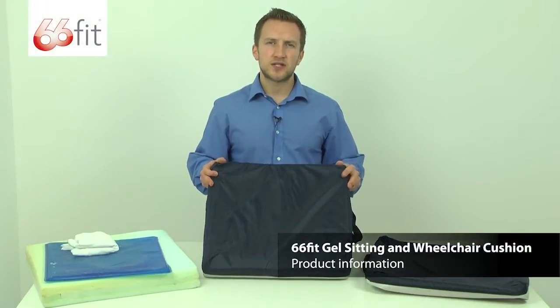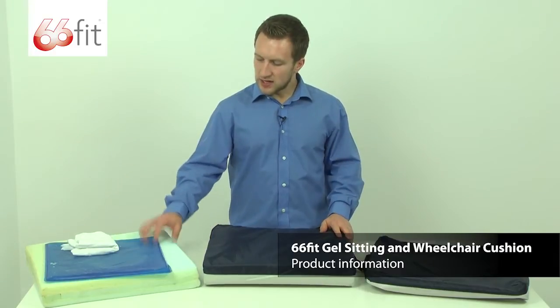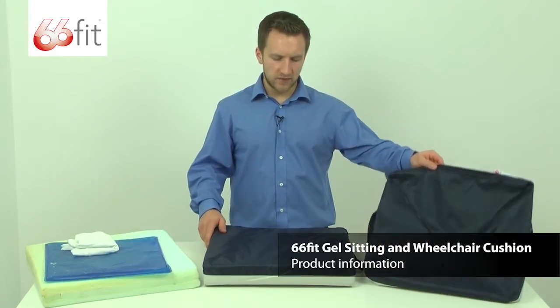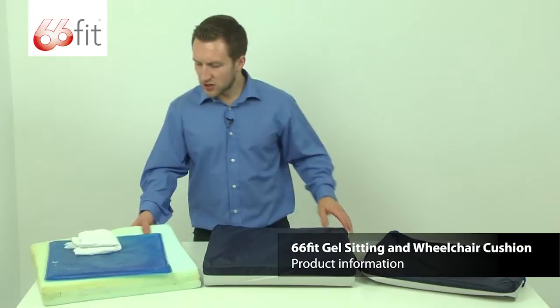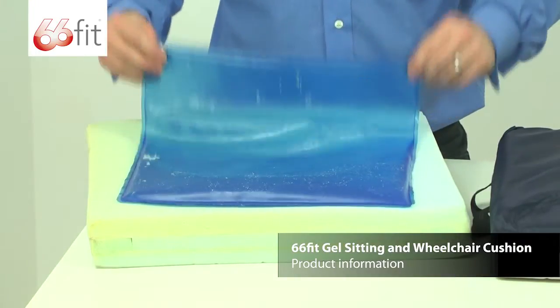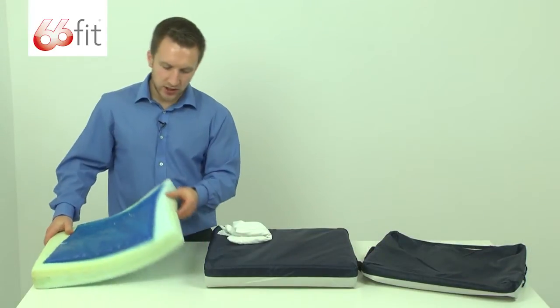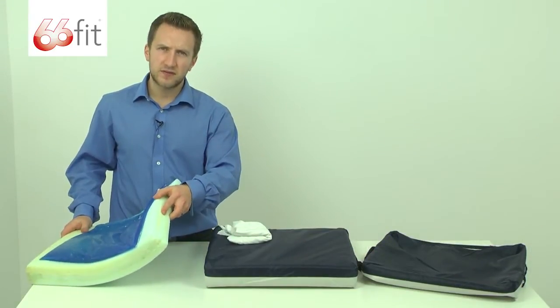This is the 66 Fit gel sitting and wheelchair cushion. As you can see, we've got one taken apart here. This is the outer cover. Inside the actual cushion itself, you've got this gel pack that you can see has been taken apart. This is basically sandwiched inside these three layers of foam.